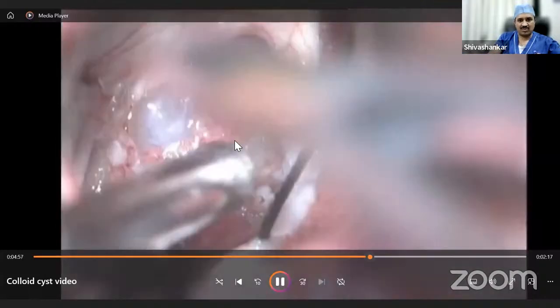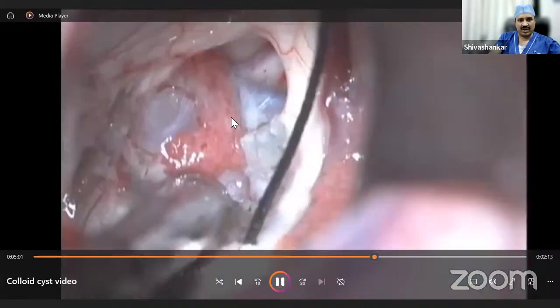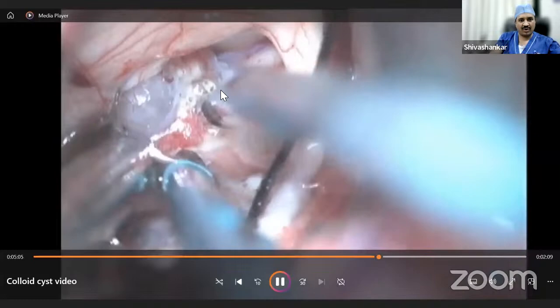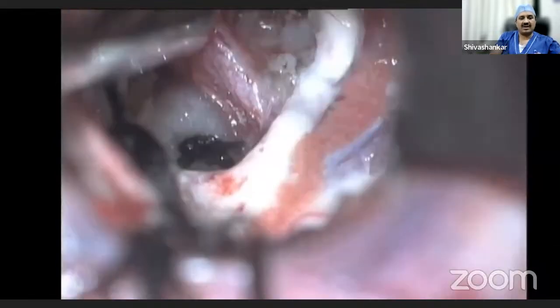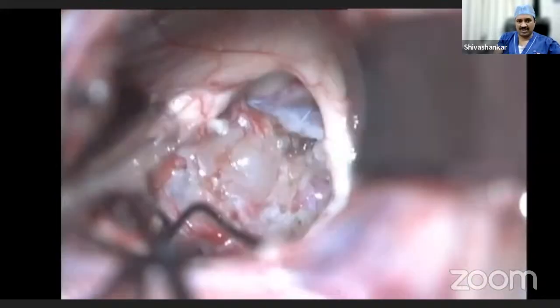And I'm cutting the cyst wall near the ipsilateral fornix here on the right side and coagulating. This is the opposite side choroid plexus, what you're seeing now. I'm coagulating it to separate the cystic content there. And once that is done, we gradually cut the cyst wall. Main dissection of the cyst wall is everything here because any remnant can cause a residue.